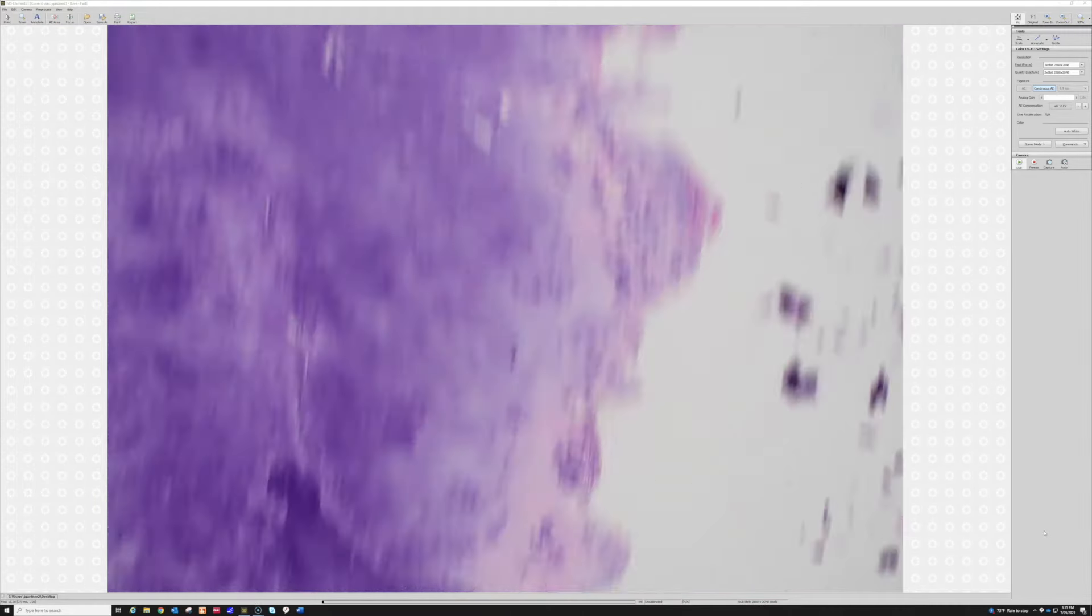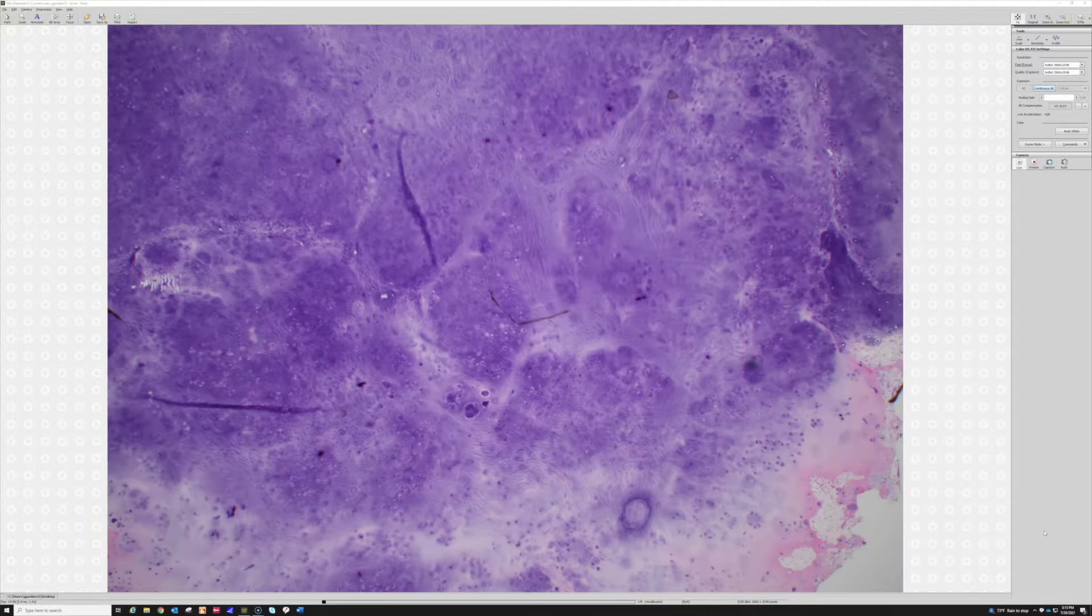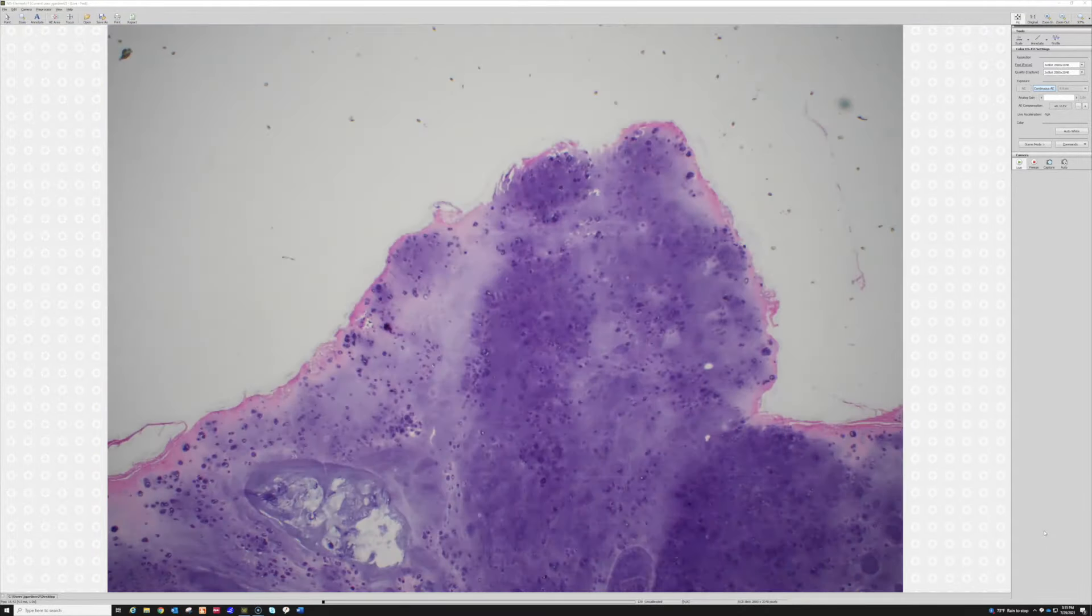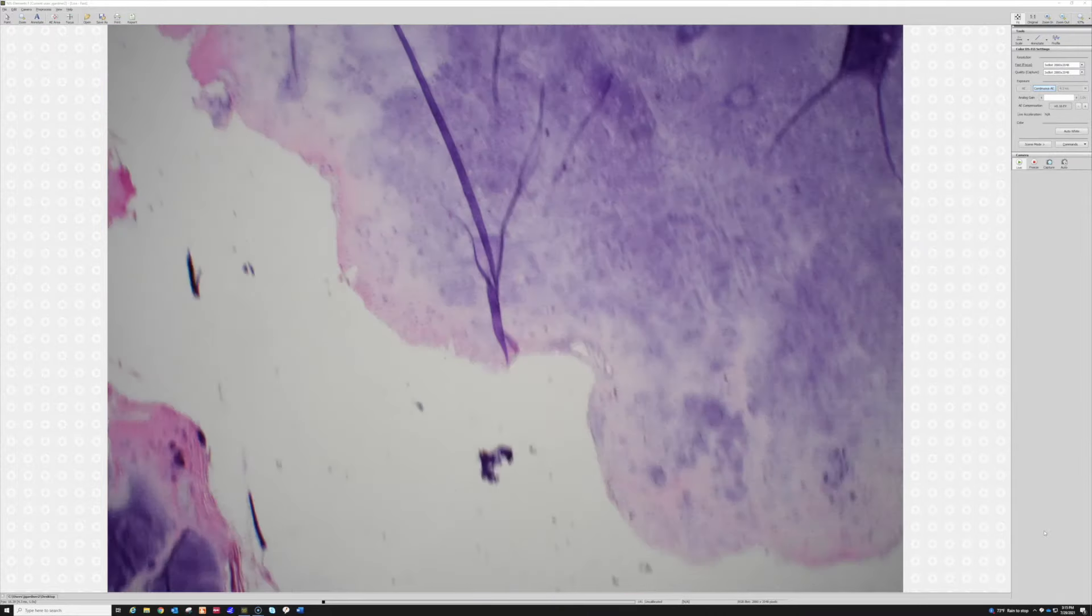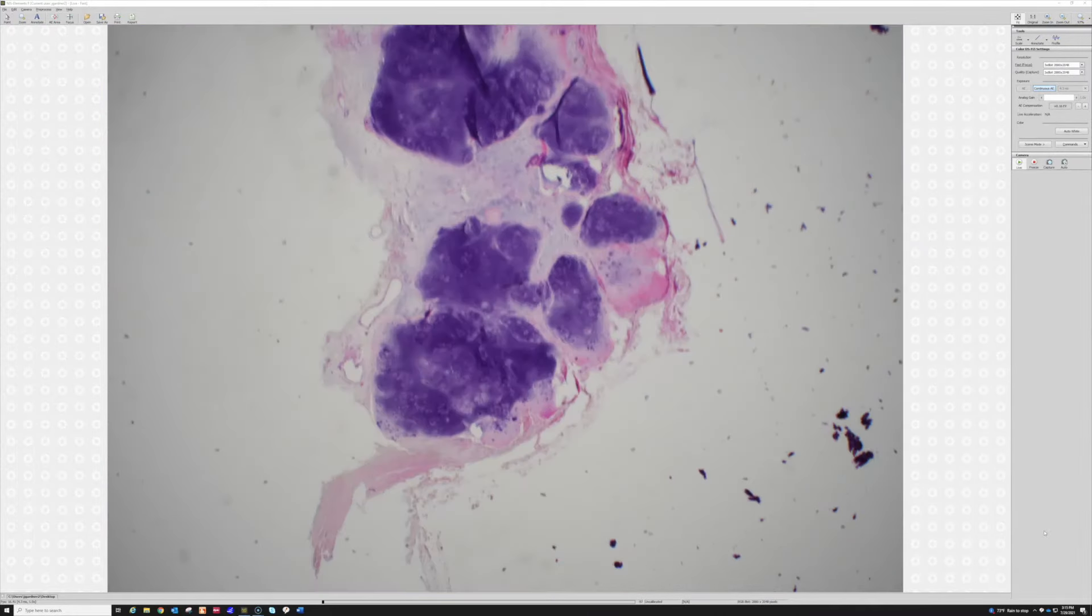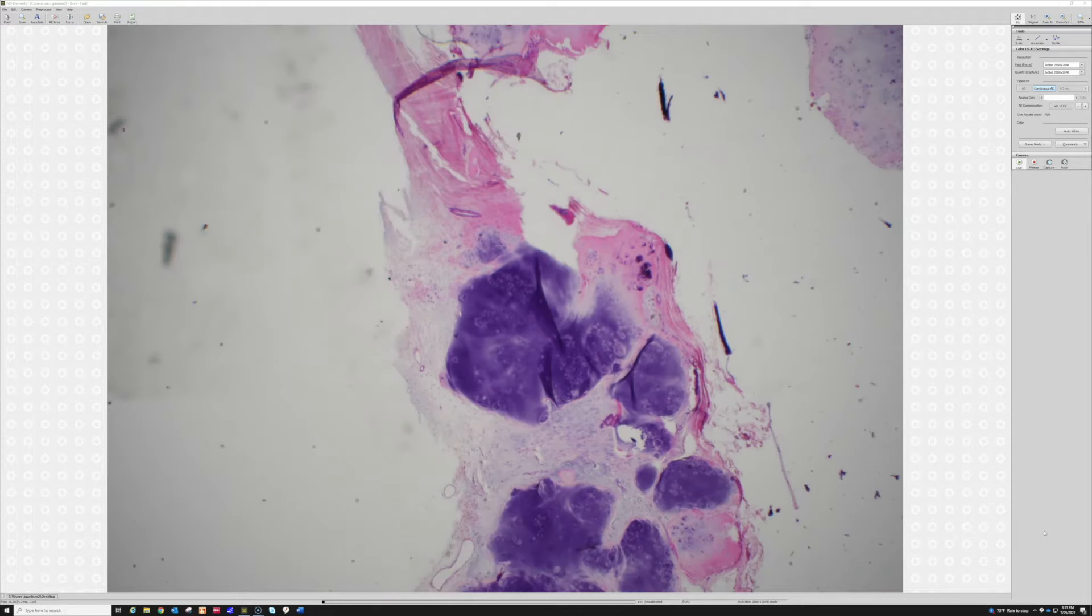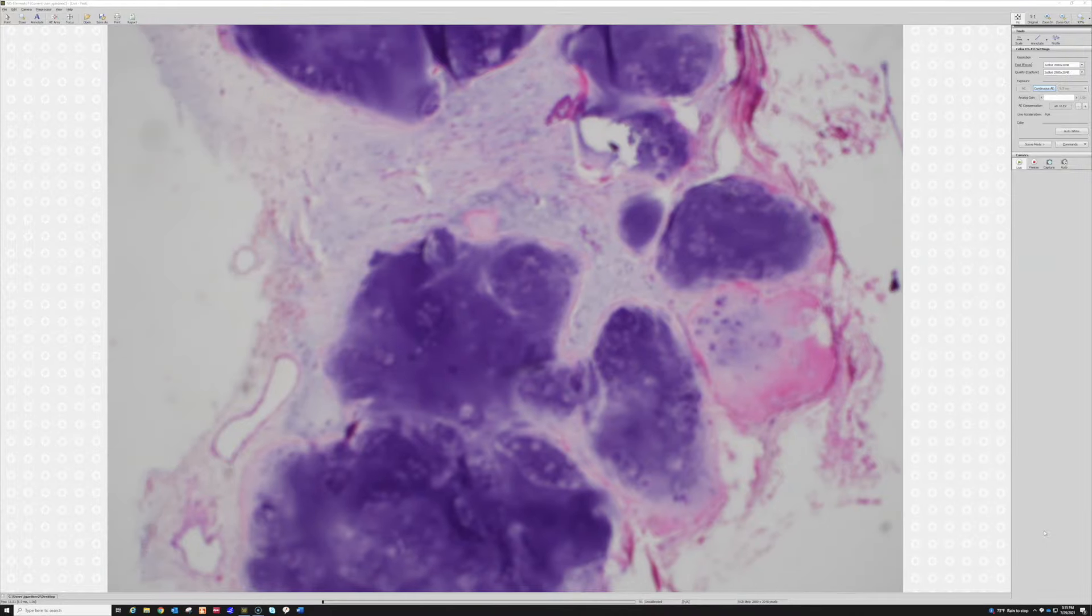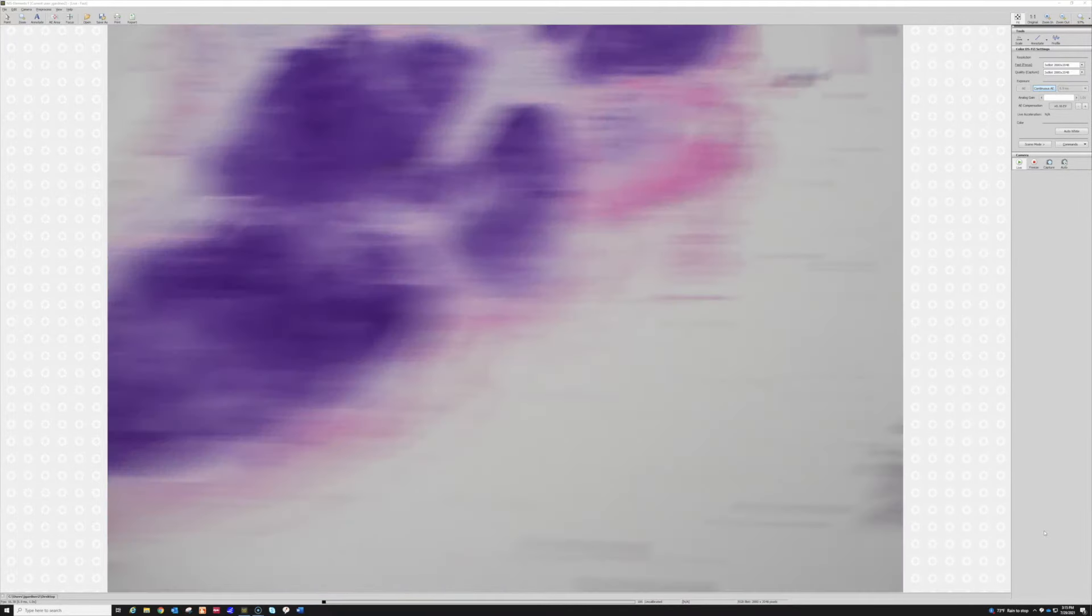So from low power, we've got a big huge mass of cartilage here, but also we've got multiple little discrete islands in a background of reactive fibrous and myxoid tissue. So what is this - these multiple islands of cartilage that are benign appearing?